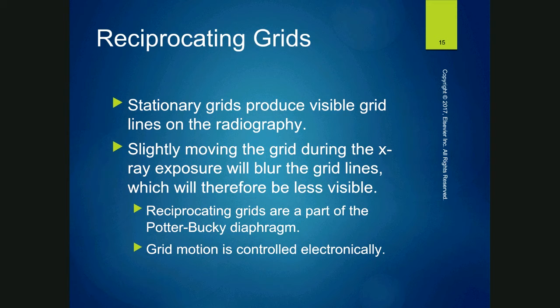But the reciprocating part of the grid, I'm pretty positive, was invented by Hollis Potter, and then Gustav Bucky invented the grid, I'm pretty sure. It's probably in your book, and I probably just said it backwards, but that's pretty close to what it's supposed to be. But anyways, that's why we call it a Bucky, because it was named after these guys. I feel like I rambled a lot on that one, but that's okay.